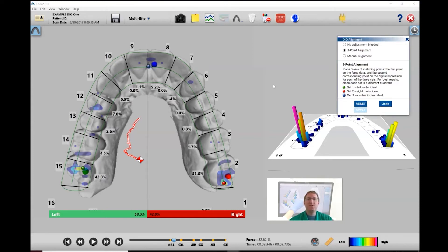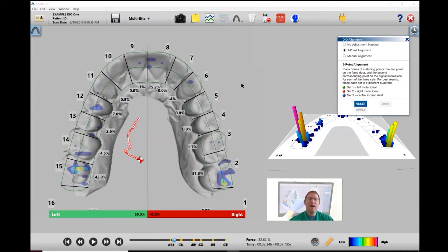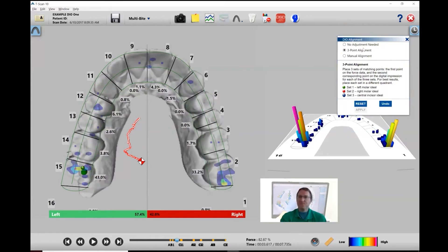And you'll see that the T-Scan software will automatically realign the digital overlay based on those three data set points.